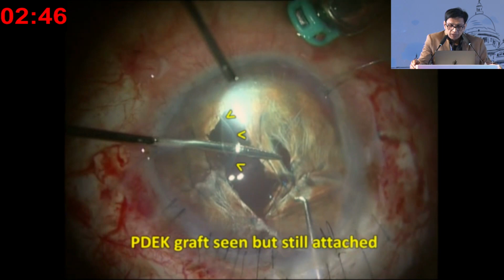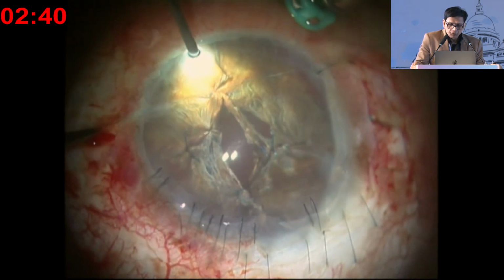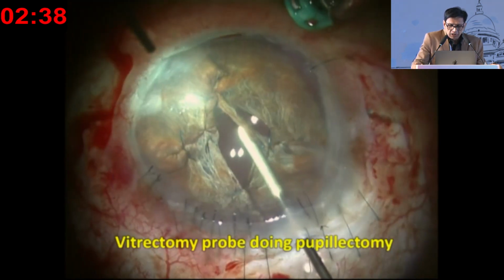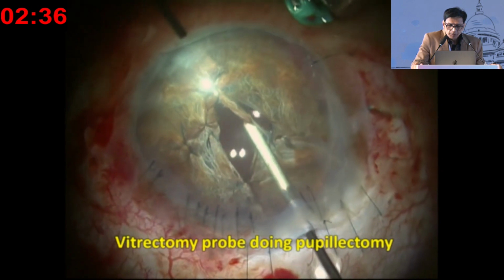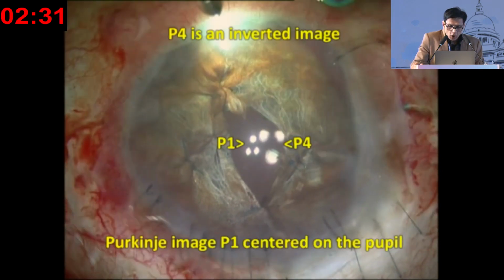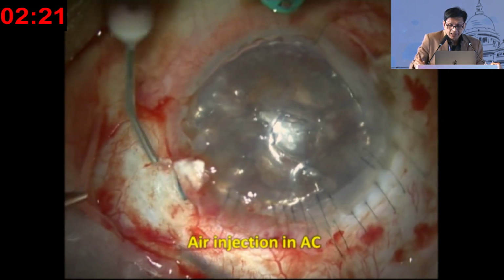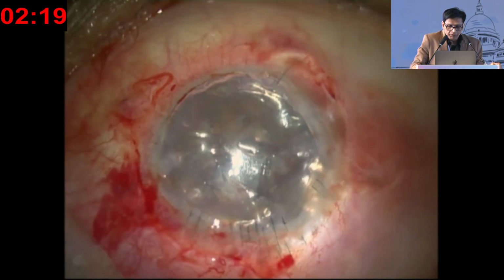So I thought, let me not test my luck anymore. After this gets fixed, now I say enough is enough. I'm just clearing up this pupil area there, and you can see there the Purkinje image P1. Look at the inverted Purkinje image, that is P4. Don't worry about that. But touch wood, the advantage in this whole surgery, if you notice, is my PDEC graft has not dislodged, and that's a big advantage of PDEC. So now I fix my glue.